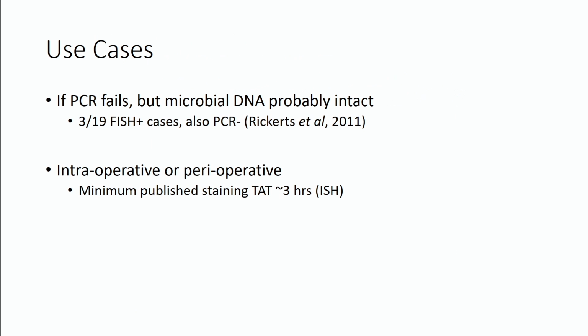In terms of the use case, I think there are really two opportunities. One is when PCR fails, as I mentioned. The other, you can imagine that this could be useful as a perioperative type of rapid diagnostic. So the Montone group has been able to get the staining time down to 3 hours or less. So you'd still have to be able to cut them, but one could imagine having an intraoperative consult where frozen section is positive and then moving very quickly to this FISH assay. Again, patient selection would be important, but I'm just trying to think ahead and decide when we might use that.